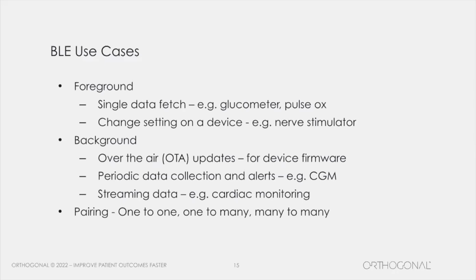Another thing to think about with these use cases is when you are doing pairing, typically you're trying to do one-to-one pairing, but you may have one-to-many pairing or many-to-one pairing, or even many-to-many pairing situations. An example here might be if you have multiple children with CGMs, and you are the one that is monitoring this information, then you may be pairing with multiple devices.